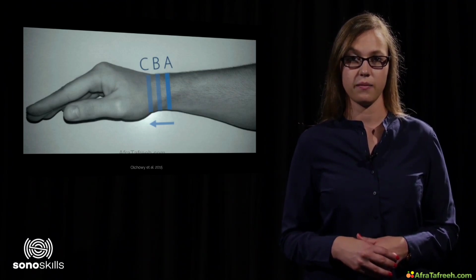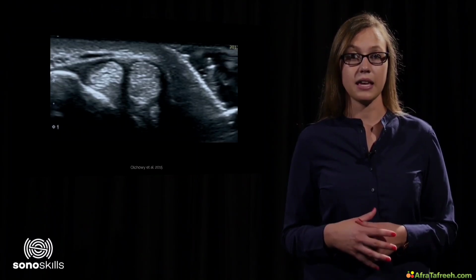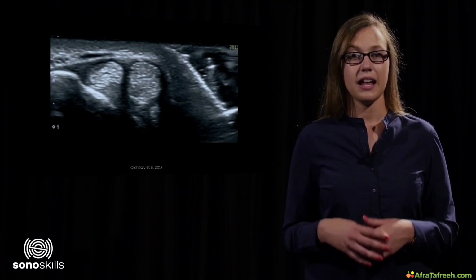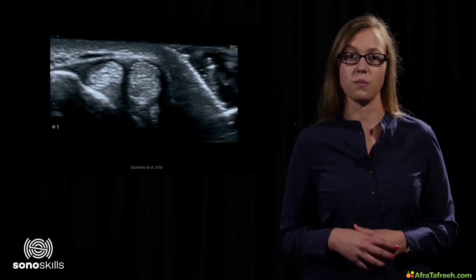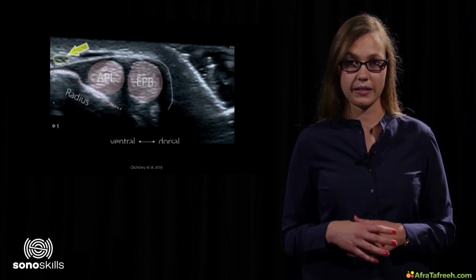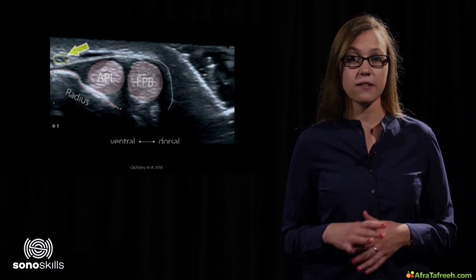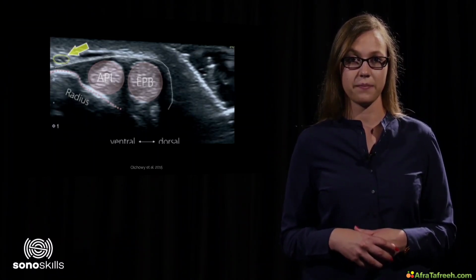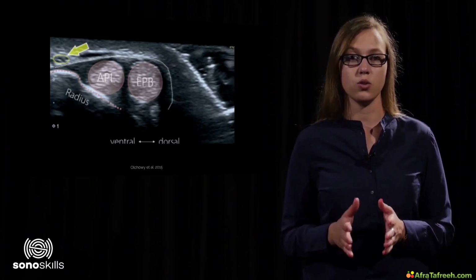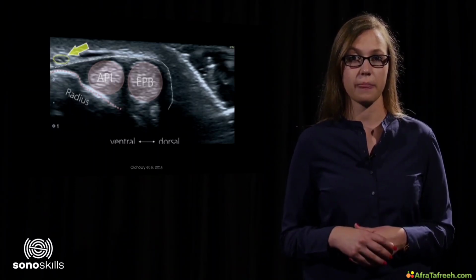transducer distally. On the ultrasound scan, the anatomy found is the APL, the EPB, and the superficial branch of the radial nerve. Let's highlight these structures for easier interpretation. Do you see both tendons underneath the hypoechoic tendon sheath? As mentioned before, the APL can show several tendons due to its variability. Please notice the hypoechoic tendon sheath tissue between the 2 tendons, which divides this first compartment into 2 chambers.